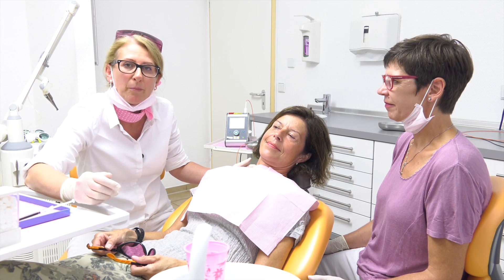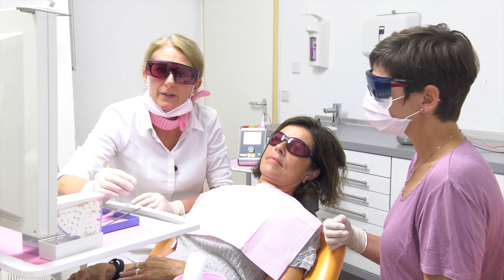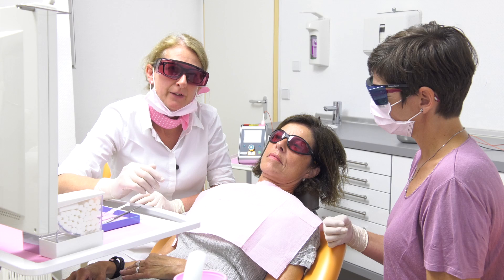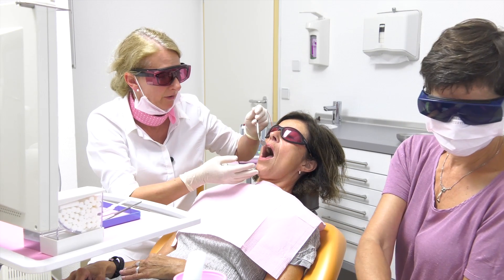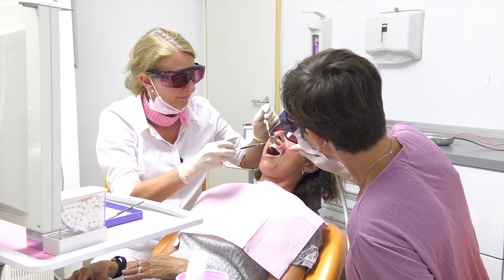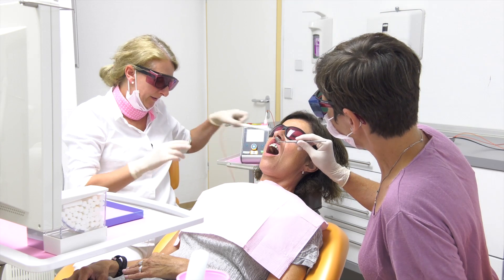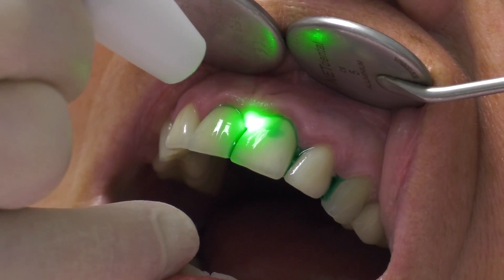I choose the diode laser combined with a special dye. For treating the periodontitis using the diode laser, you have the choice between using a blue colour or a green colour. Today I decided on the green dye, and therefore we need three different light fibres. Now we take our colour and we put the colour along the gingiva like this. Then we take the fibre and we move the fibre above the gingiva like this, for 10 seconds.